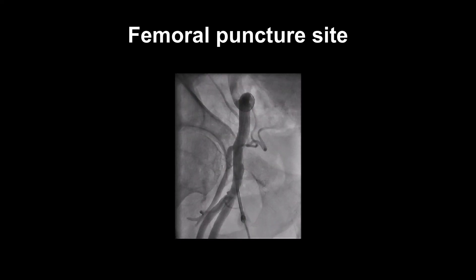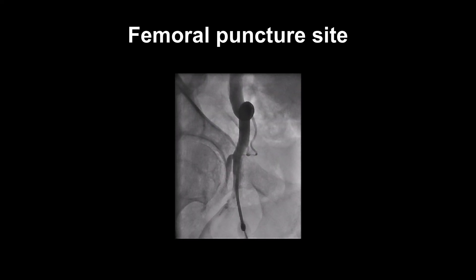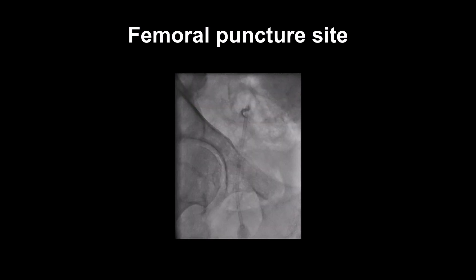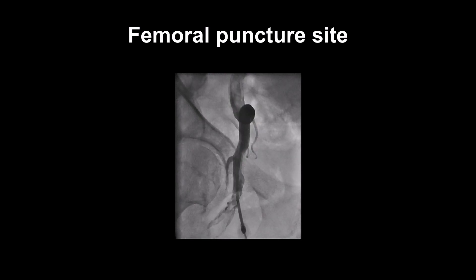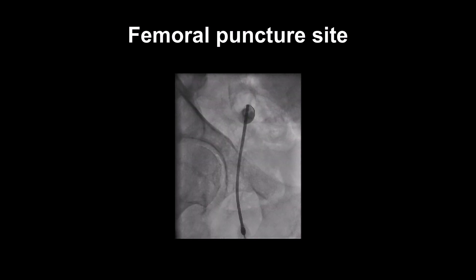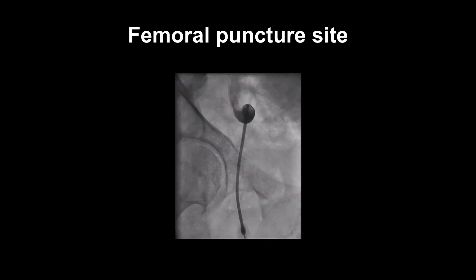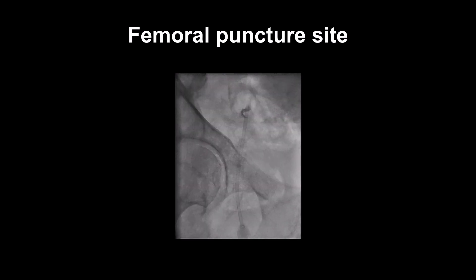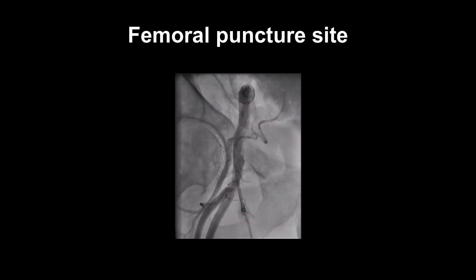This is a femoral angiogram via a sheath to show the puncture site above the bifurcation. Note that the entry point of the artery is where the sheath seems to bend slightly and is opposite the femoral head. Sometimes waggling the sheath a little during fluoroscopy helps identify the puncture site better — just remember not to get your fingers in the x-ray beam and not to pull the sheath out by over-vigorous waggling.